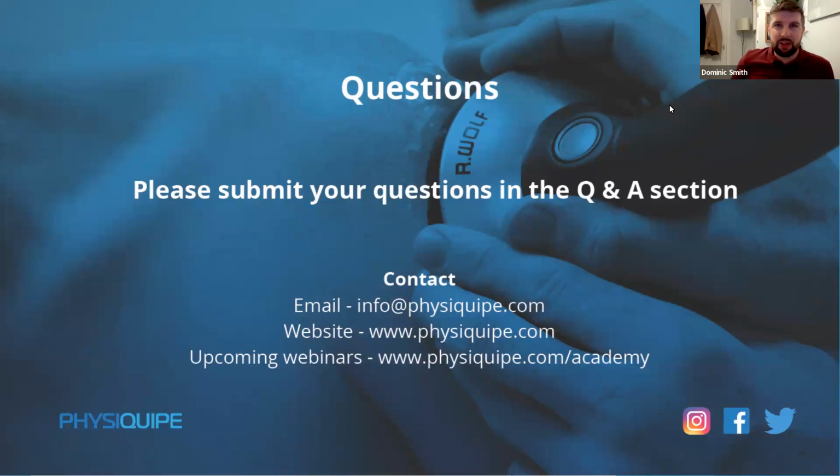But we're looking specifically at upper limb. Let's not forget we've got lower limb. We've got the bone indications as well. There's quite a lot of areas, and predominantly it focuses around tendinopathy. But the evidence we have available to us around the physiological changes, you can take that across to ligament injury. Like I've treated AITFLs, ATFLs, MCL, after major injuries, surgeries, repairs, and have some really good results. So there are some things that we can translate and move across indications.